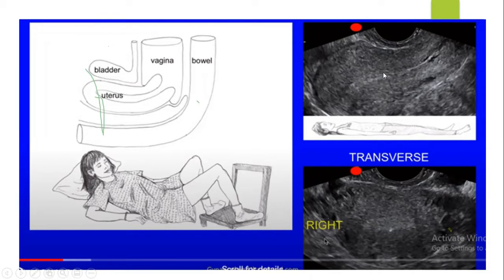This is the endometrium, and what we are not showing you is the urinary bladder. Always keep the urinary bladder on this side. If you're holding the probe incorrectly, you will see the urinary bladder coming on that side. So we don't have to do that. Only sometimes, in a retroverted, retroflexed uterus, where you're not able to identify the uterus well, do we have to change this orientation, and maybe also write in the report that we have changed it.